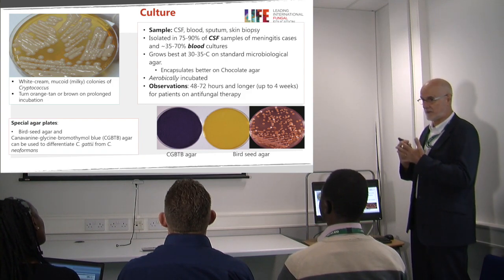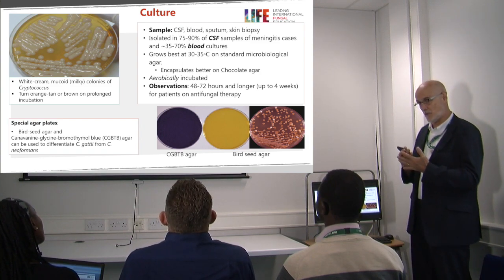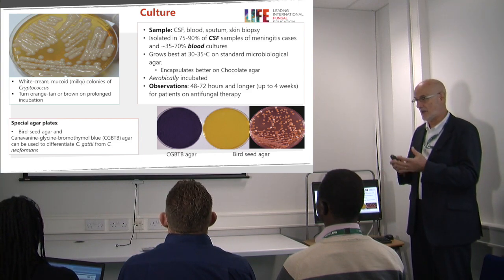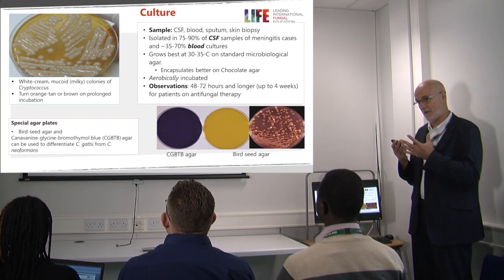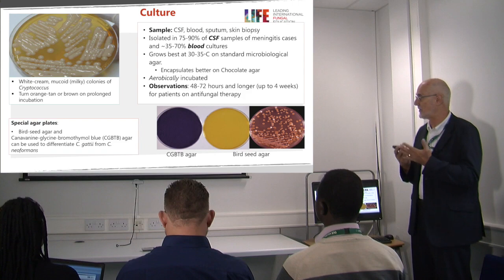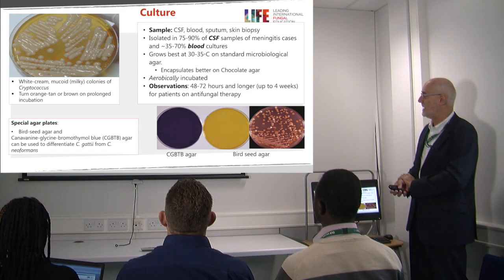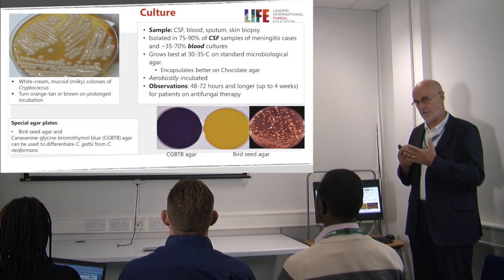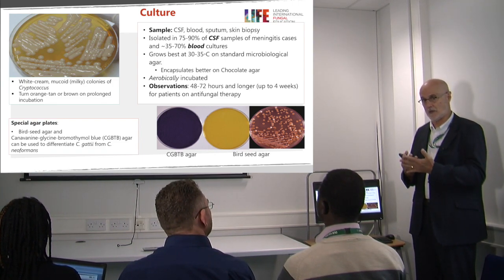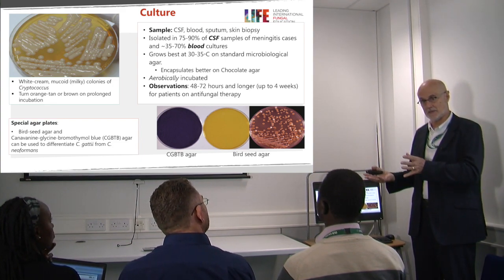So as I said, standard laboratory media are pretty good here, but media like malt extract agar or chocolate agar enhance the presence of the capsule and make it more recognizable. And you can actually carry out the antigen test on a small portion of the colony to see if it's positive for the capsular material. The organism grows aerobically, and it's best to leave the culture plates up to 4 weeks, because sometimes the organism is quite slow growing. Do not discard the plates after, say, 48 to 72 hours, as you might do for a Candida culture.